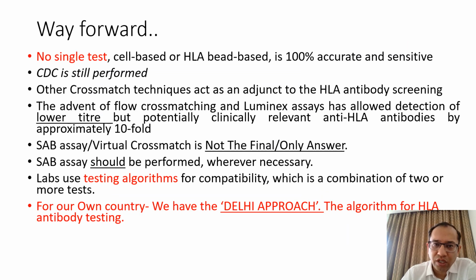So, way forward, there is no single test, cell-based or HLA bead-based, which is 100% accurate. CDC is still performed. Other cross-match techniques are adjuncts. The advent of flow cross-match and Luminex assays has allowed the detection of low titer but potentially clinically relevant anti-HLA antibodies. Virtual cross-match or SAB assay is not the final answer. It should be performed wherever necessary, but we should use a testing algorithm, and we have our own Delhi approach algorithm for antibody testing. If it suits you, you can always employ that.